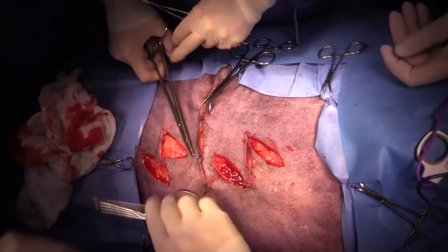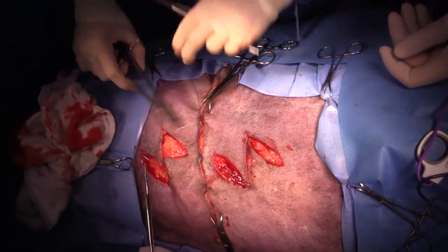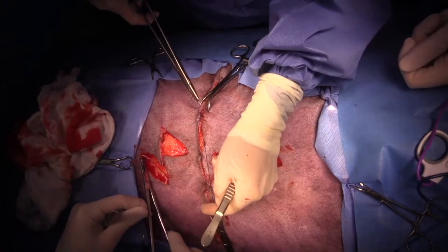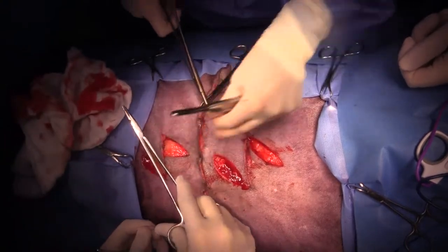Yeah, skin is great. Yep, just some nylon skin sutures. I'm happy with nylon, and you can pull that quite tight, Jeff.